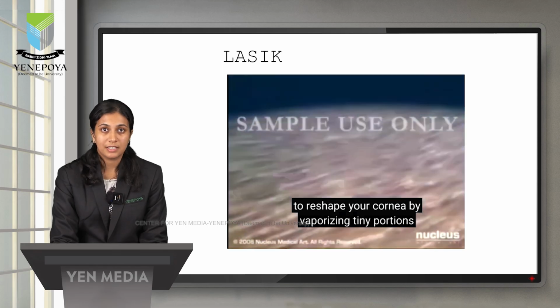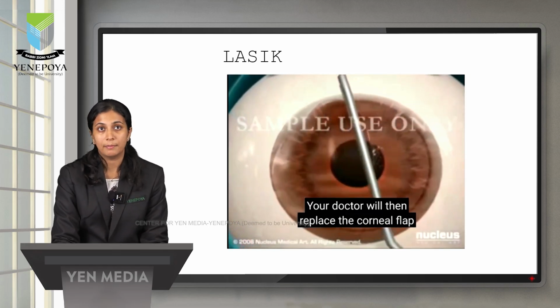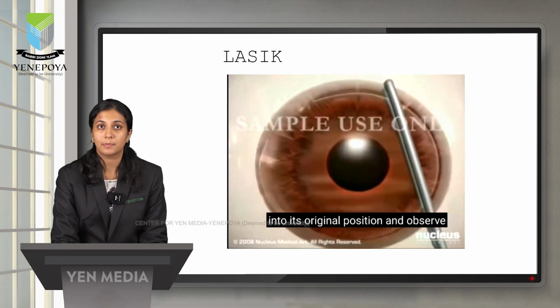Once excimer laser does the job, this flap is placed back and a BCL is placed over it.